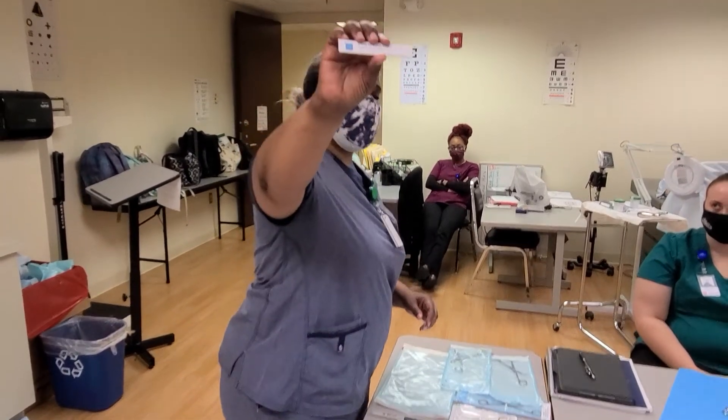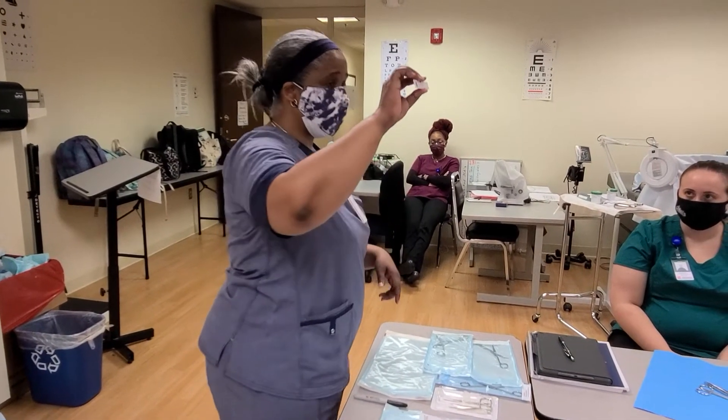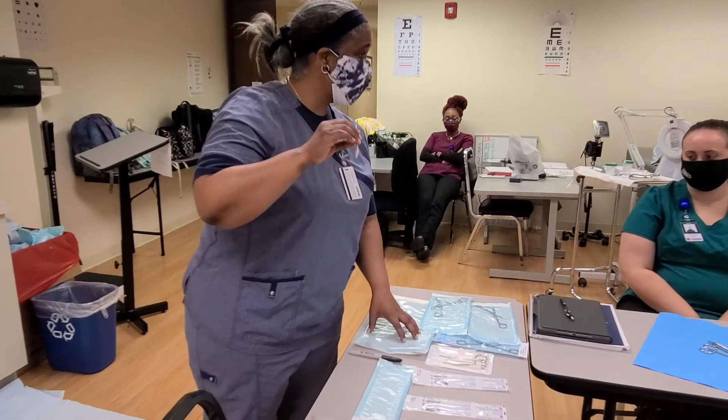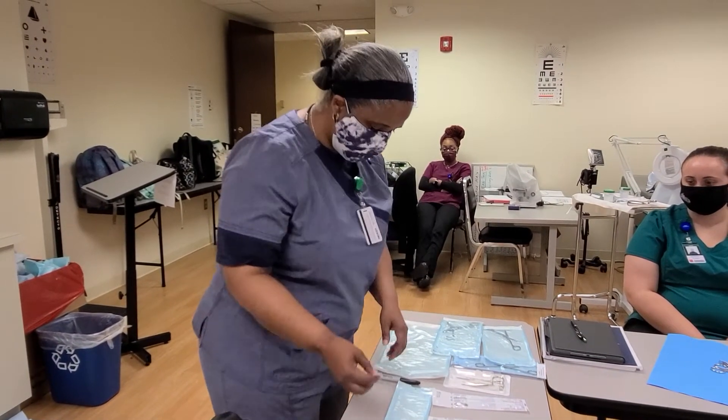This says 'steam indicator strips.' You can also put the date and the operator's initials, and here you can put the date that you actually autoclaved it. Here you're going to put the date that it expires. When I'm looking at it, I can look at it quickly, because I can't really see inside the pouch easily.